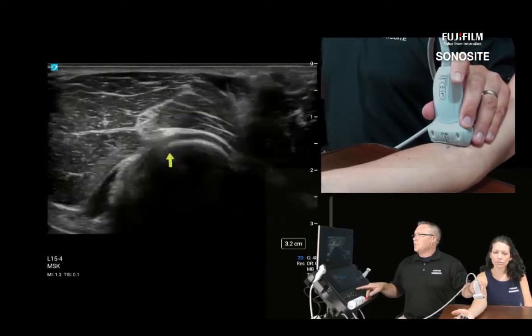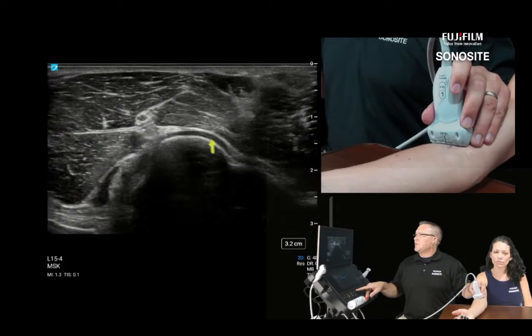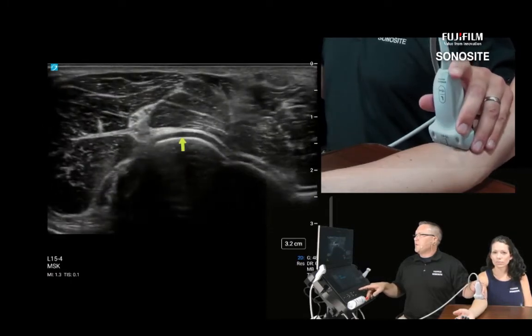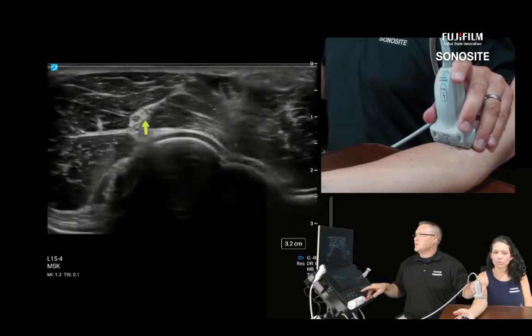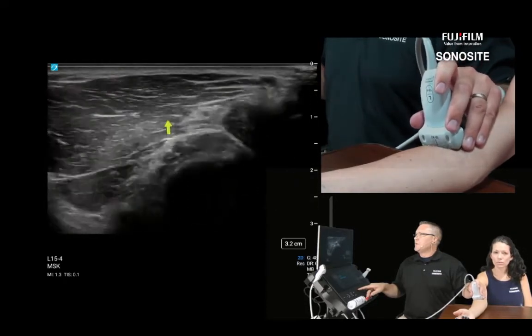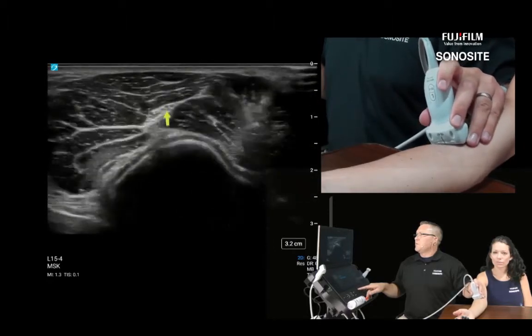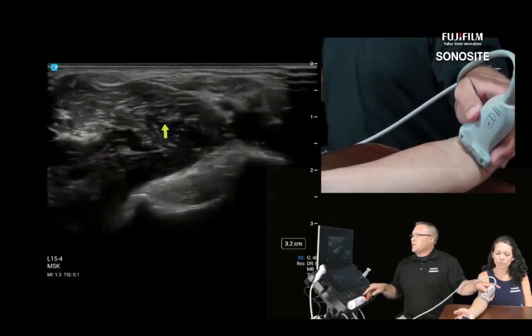Now I'm over the distal humeral capitellum area, and I'm looking at that cartilage in cross section, really nice. Kind of like looking at a distal knee, like the sunrise view. We look at that entire cartilage surface here, and as Bill mentioned in the PowerPoint, we can really see nicely that radial nerve with its superficial and deep branches. We could follow that out a little bit more distally and watch it kick out another branch into its posterior interosseous branch here, going into the arcade of Frohse, for example. I'm going to go right back up approximately to the cartilage level, and I've already evaluated for the effusion here. And again, checking medially right over that fat pad here.